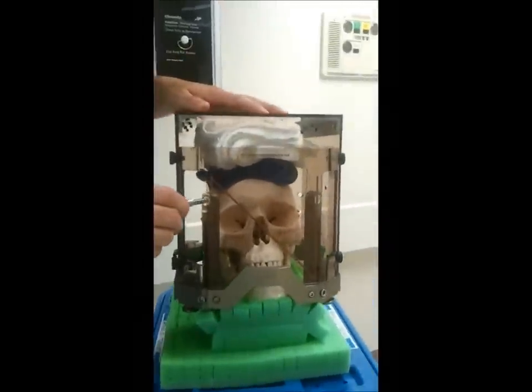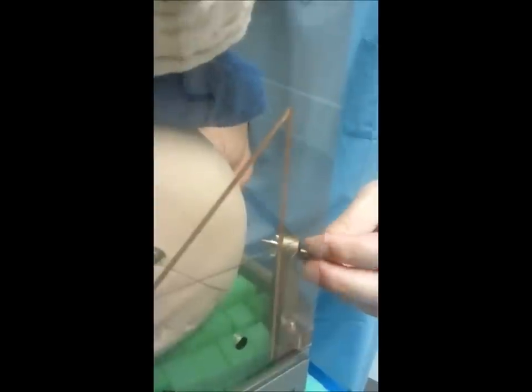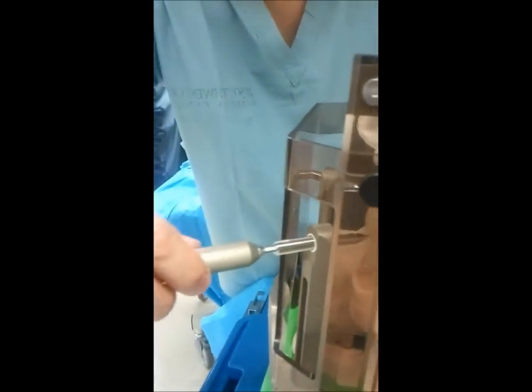We'll go ahead — and obviously in a real-life patient you'll have injected the patient first. After you've pre-measured your screw length, we'll start placing these in where they're not touching the skin in a live patient to get them started. Today I have two screwdrivers, so we'll emphasize placing opposite corners.